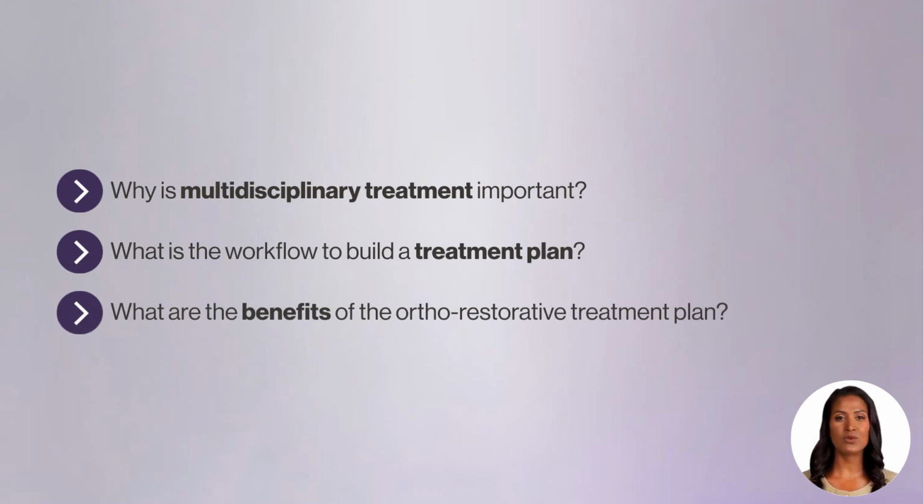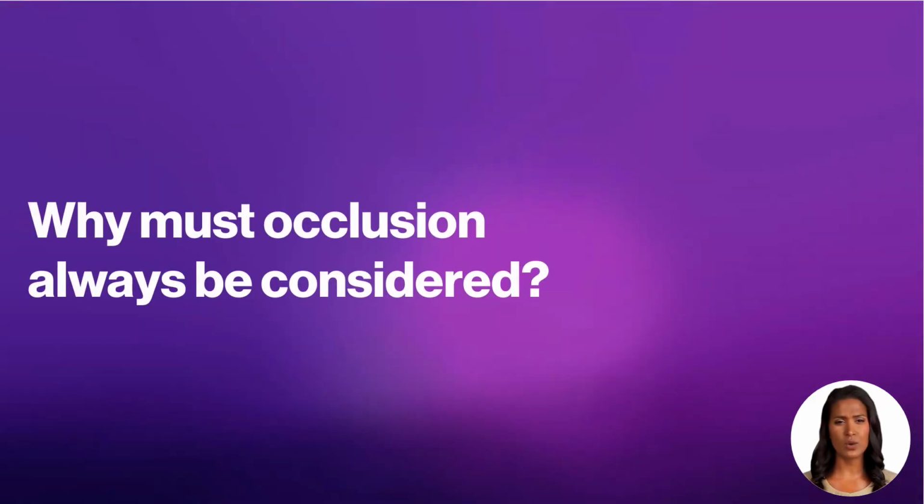Then, we'll walk you through the end-to-end ortho-restorative workflow and see how iTero's tools and features support each step, helping you deliver efficient, predictable, and patient-focused outcomes. First of all, why must occlusion always be considered?